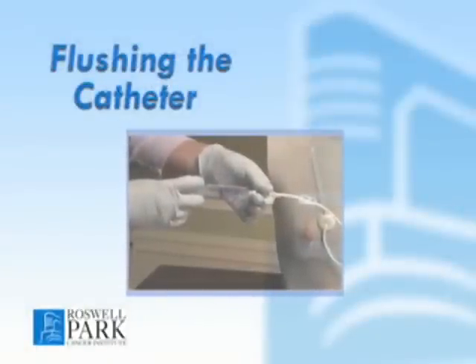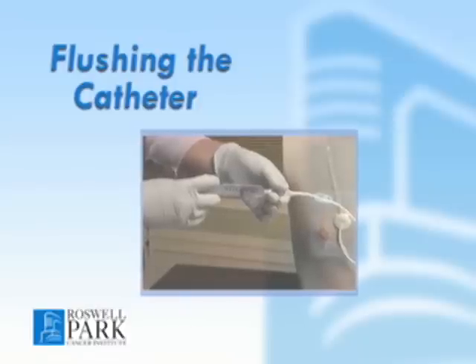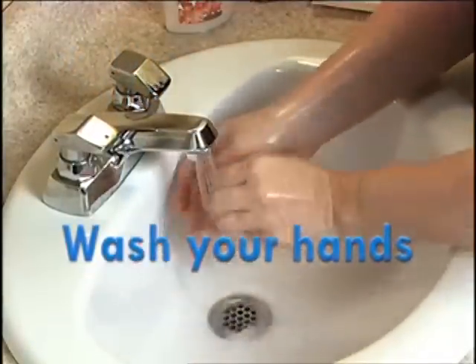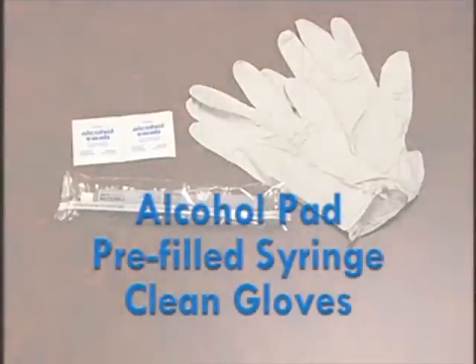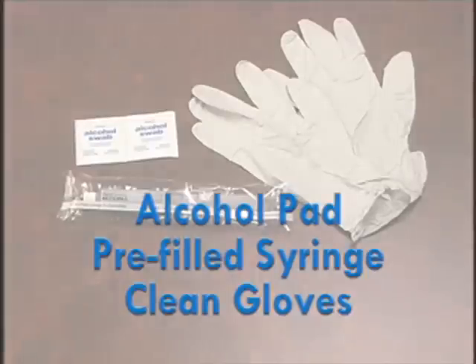Flushing the catheter is important to maintain the line and prevent blood clotting. As always, before caring for your line, thoroughly wash and dry your hands. Gather the supplies and assemble them in a clean work area. You will need an alcohol pad and a syringe pre-filled with the solution that was provided to you, and clean gloves.